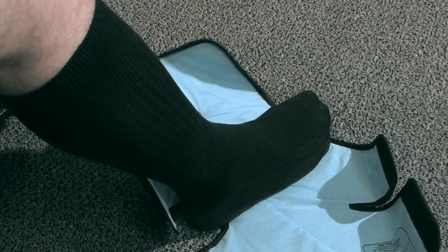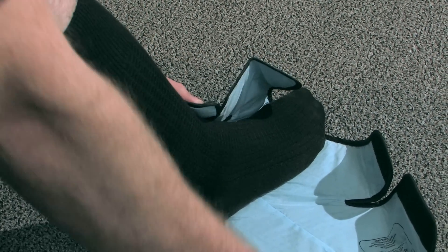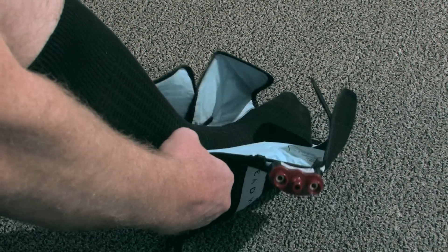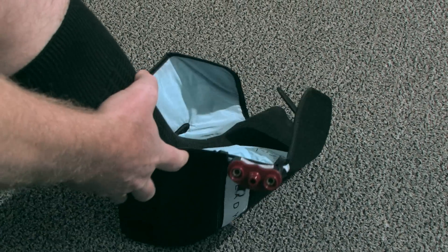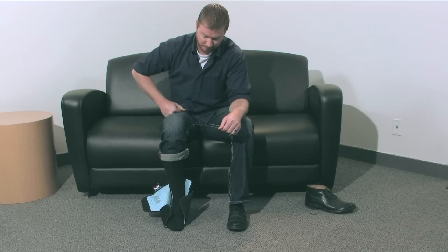Secure the back of the wrap by grabbing and holding the left flap against your lower calf. Take the right back flap and fold over the left and attach. Slide your heel to the back of the wrap.